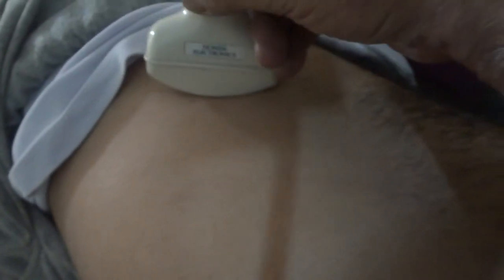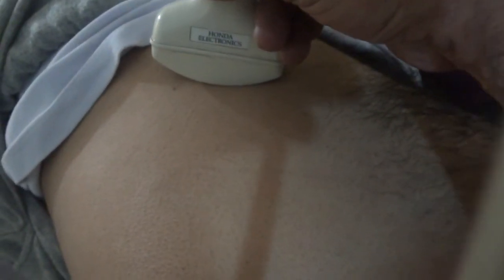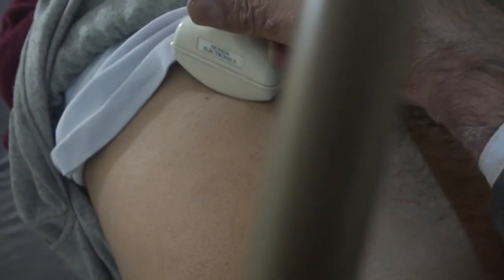These intercostal spaces are used to scan the portal vein and its branches. For the posterior branch of the right portal vein, we turn this way. We will have to move the probe downwards, and for the anterior branch we may have to angle it upwards.